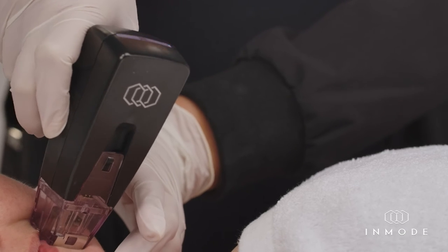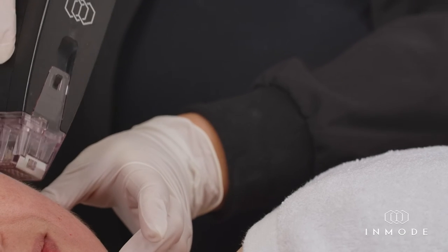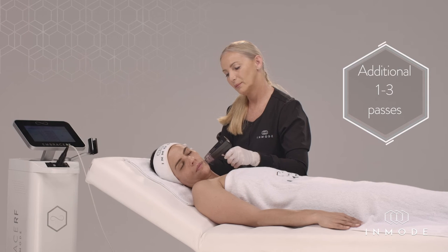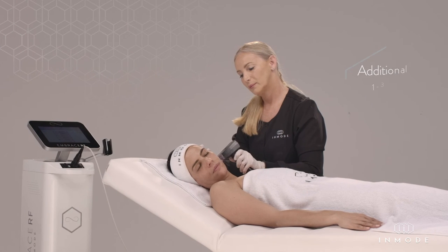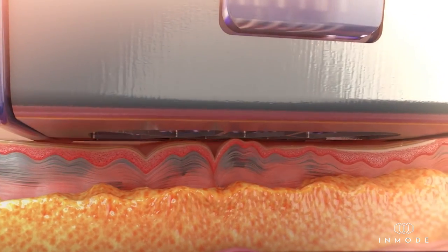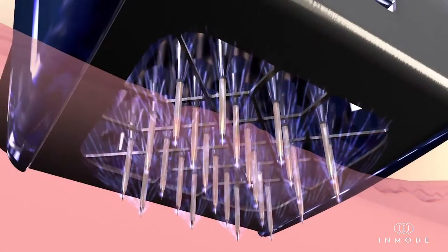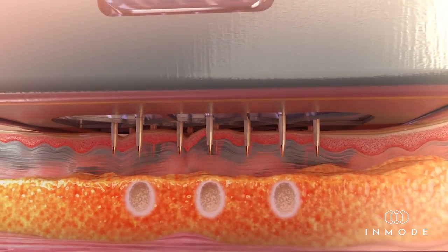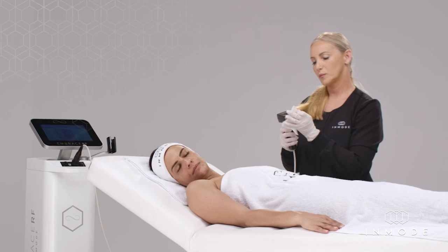One to 2 additional pulses may be triggered at the same site (stacking) in fixed mode. However, do not stack pulses on bony areas such as forehead, periorbital, jawline, etc. If gaps are visible after the full area treatment, they may be retreated immediately. Additional 1 to 3 passes may be necessary to optimize results. Wait until the full area is treated before attempting an additional pass, allowing for a delayed response. An additional pass may be applied in a different direction to the previous pass or passes to ensure complete area coverage.